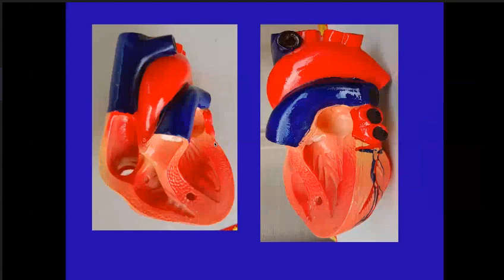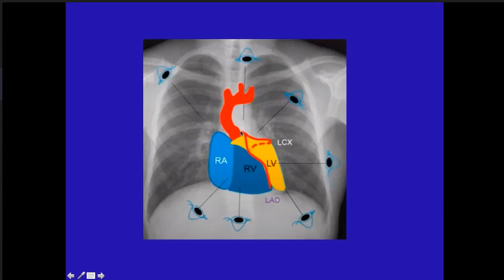See, look at the left main coronary artery here. If you do a straight LAO angio here, you are looking along the length of the left main coronary artery and the proximal LAD. Can you see that? So the left main coronary artery and the proximal LAD will be foreshortened. Therefore, you may not be able to see the details of the proximal LAD very much here.